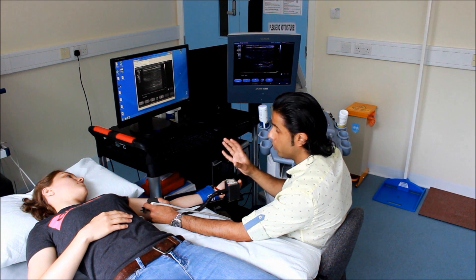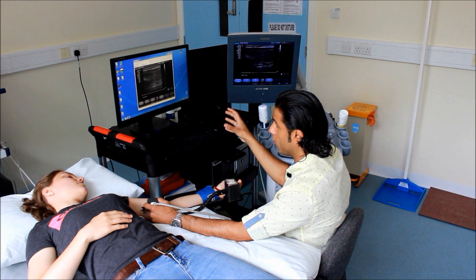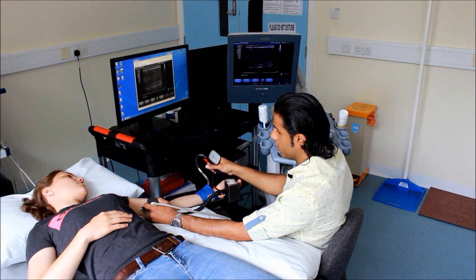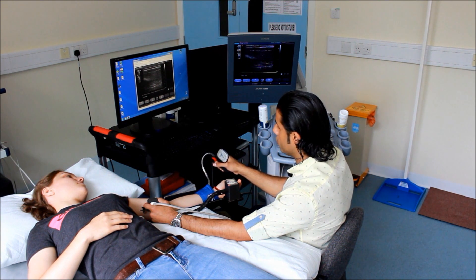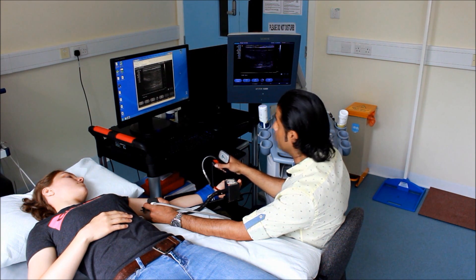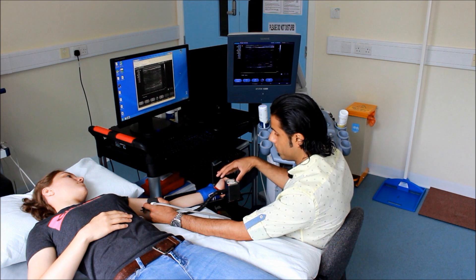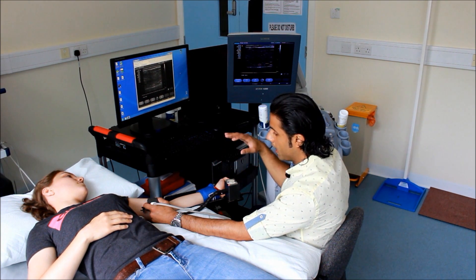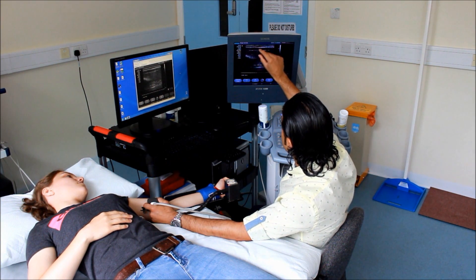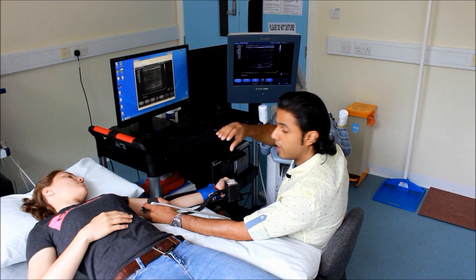The next portion of the technique involves a 120 second or two minute measurement of the baseline artery diameter. You also have the specific automated edge detection software to record those vascular diameters, which will help you in post-processing for the images. Once you've recorded the diameters, you are then going to inflate this blood pressure cuff. Generally we inflate it to about 50 millimetres of mercury above the participant's systolic blood pressure, but I tend to go to around 220 to 240 millimetres of mercury. The blood flow to the hand has now been stopped, and we're going to maintain that for approximately five minutes.